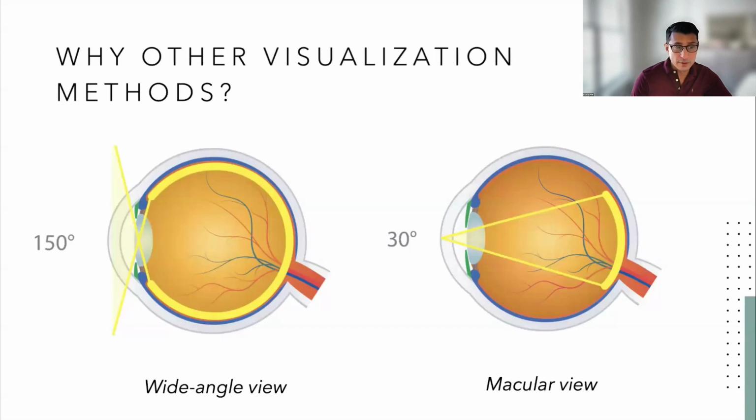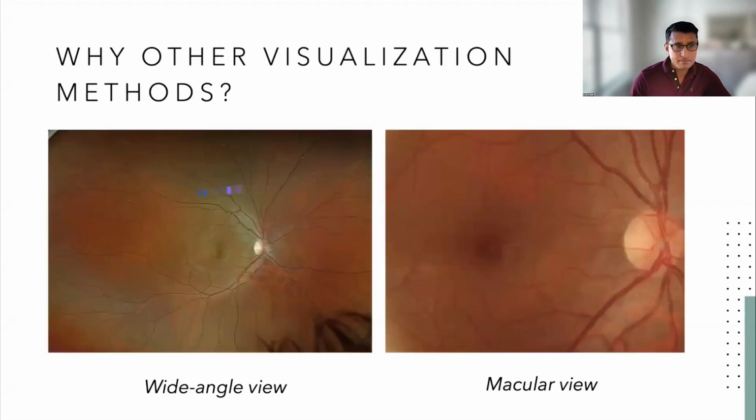And here you can see the nodal point where the focal plane lies is different than a direct macular view, right? There it has to lie inside the eye, and, this picture depicts it very well, because of that, it has to flip the image. So we're going to talk about how reversal of the image factors into wide angle viewing, but you can see a lot more this way. And of course, by doing so, you minify the image. So you get a wider field of view, but you make a smaller image.